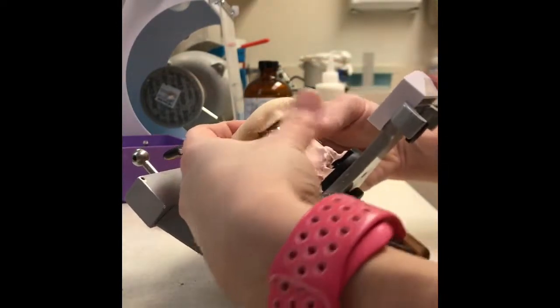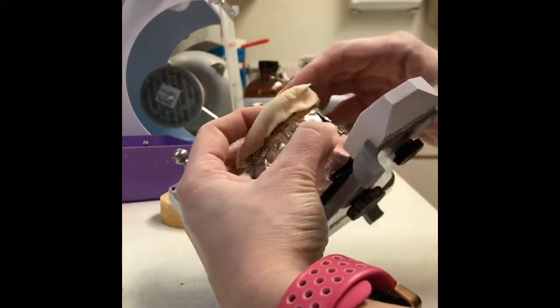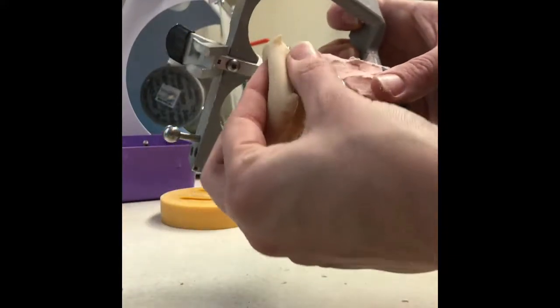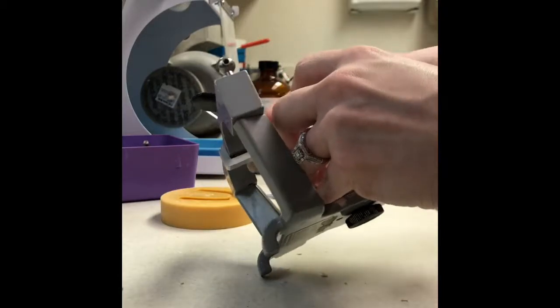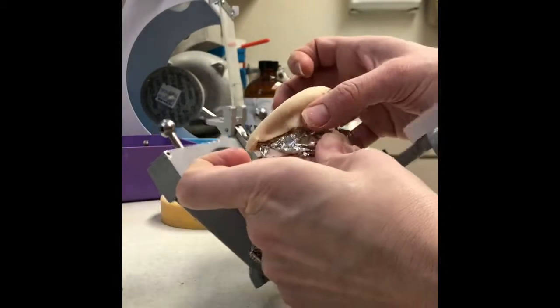that we need to make sure that it's actually long enough. So kind of pushing down and pinching, so we're not losing any of the length. We're not pulling it down, but almost pinching it down to make that crease there.